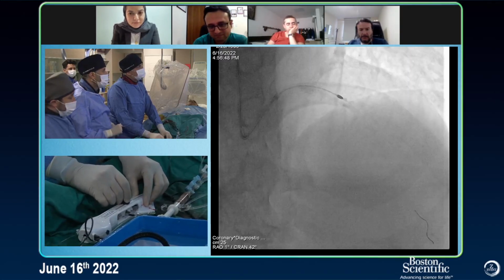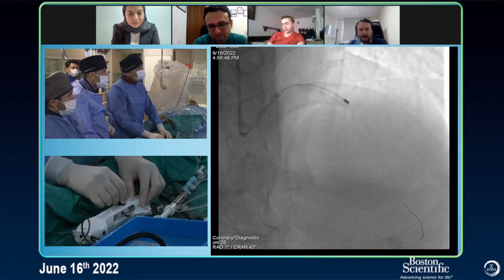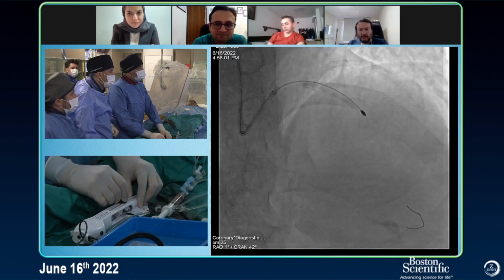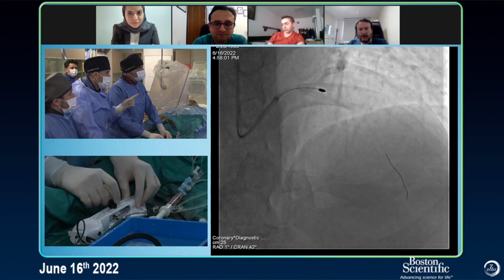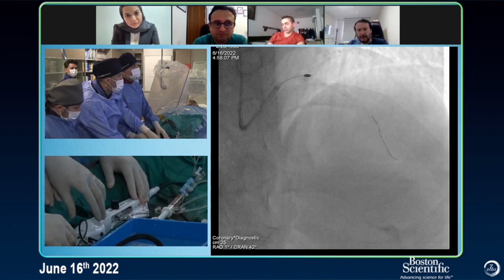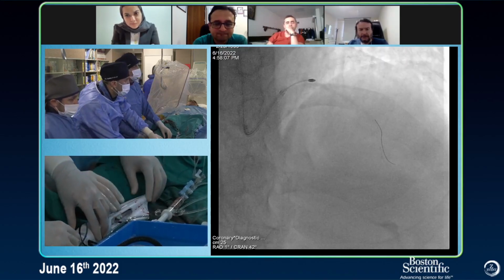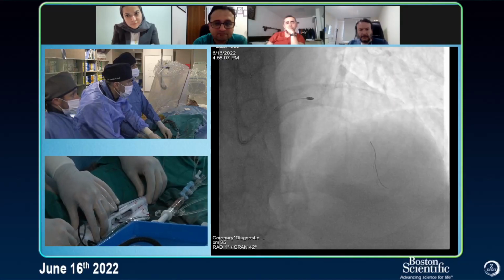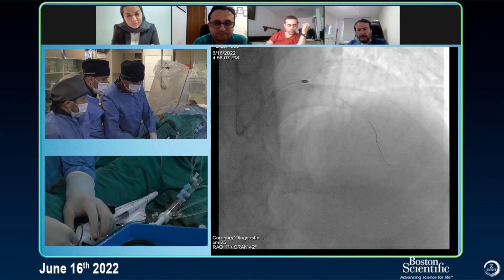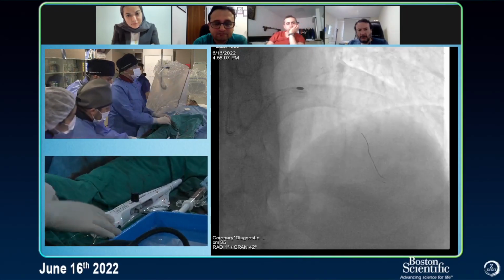Each round should be around. I have some resistance here. If I have light resistance, I can push forward. Okay, stop. Hold the wire. So I come a little bit back. Can I push my wire slowly, a little, gently? No, I cannot. Probably it is locked.